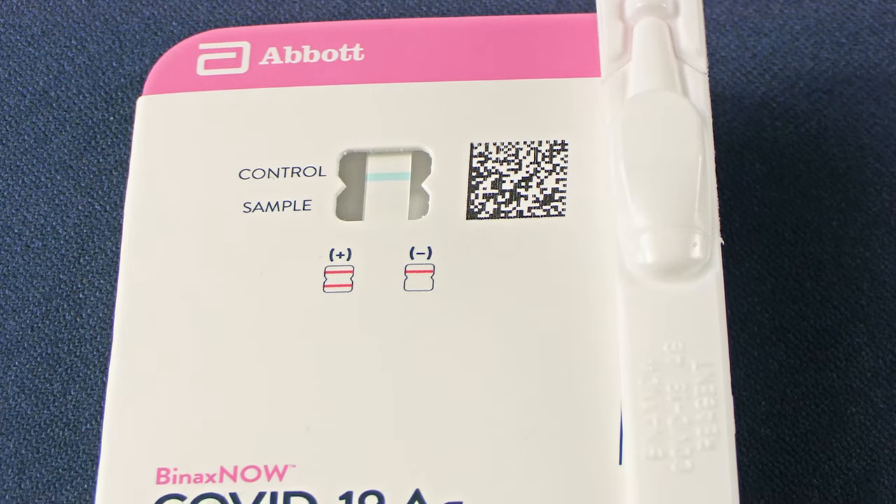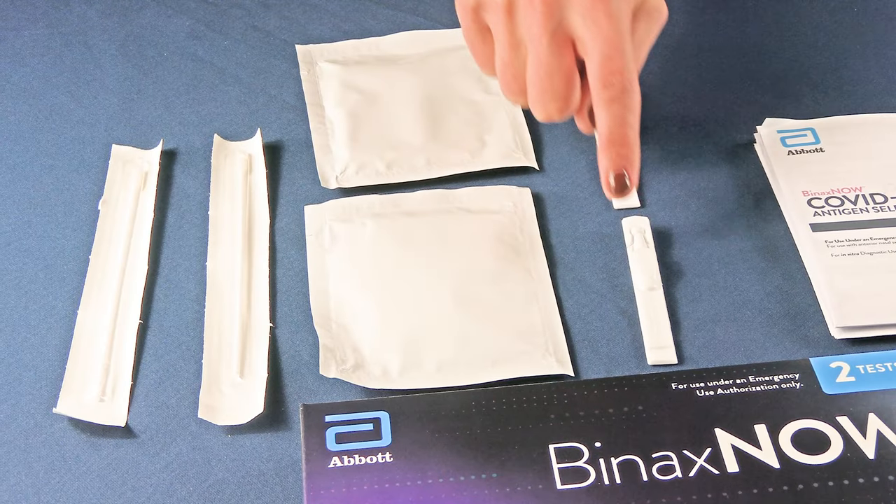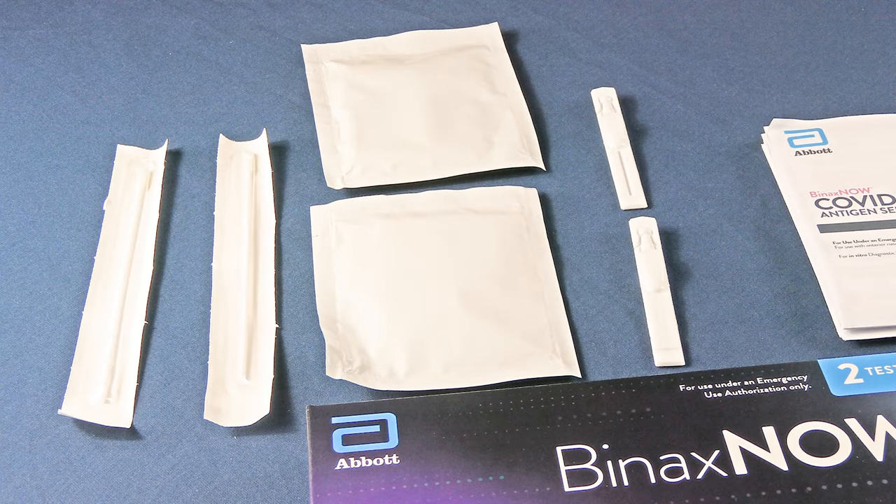The Binax Now kit comes with two test cards, two tubes of extraction reagent, and two nasal swabs. Do not open items until actual use and use on clean surfaces.